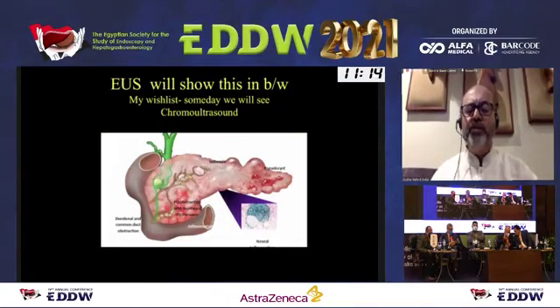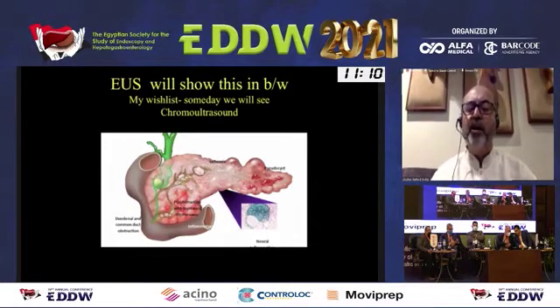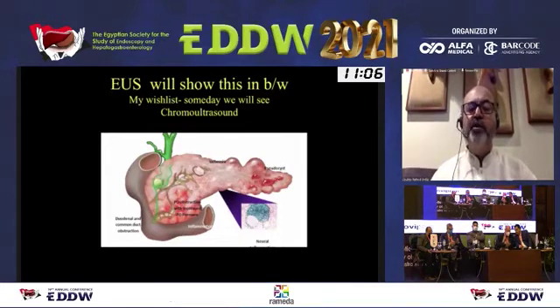So what do you do with EUS? Now, this is my wish list, that I should see EUS like this in color. And maybe in a few years from now, we will have artificial intelligence and we will have colorful EUS and not black and white.